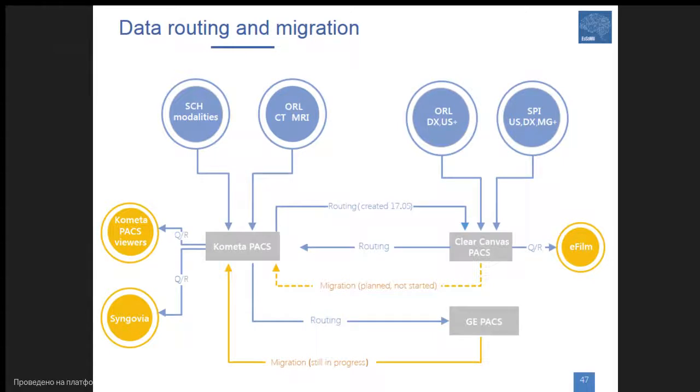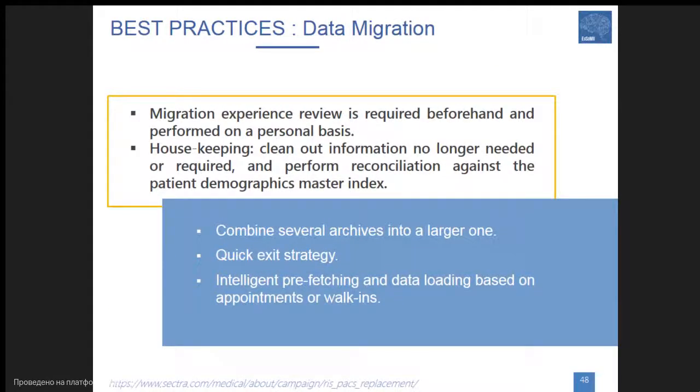When you have several PACS systems and you need to migrate from one to another, you need to have several processes running at the same time, like routing, rerouting from one PACS vendor to another. And once the data sets are the same, the databases are the same, you can switch the old one and move to the new one. Anyway, the migration takes a lot of time, a lot of effort, and almost never is it completed with 100% efficiency.